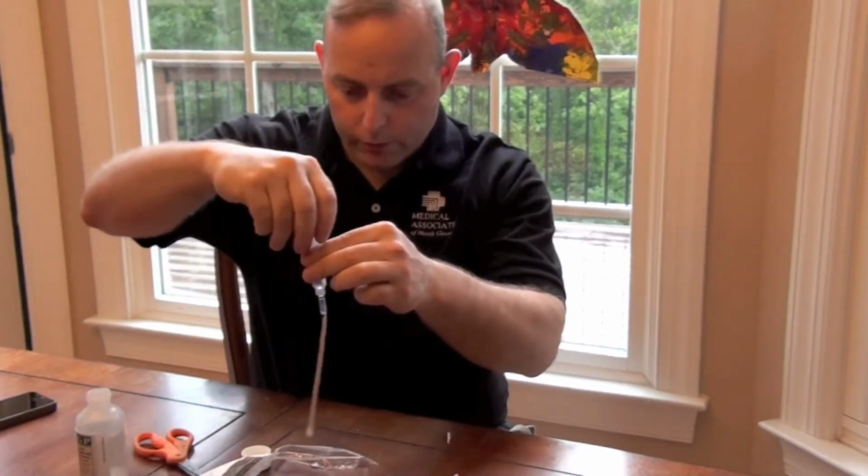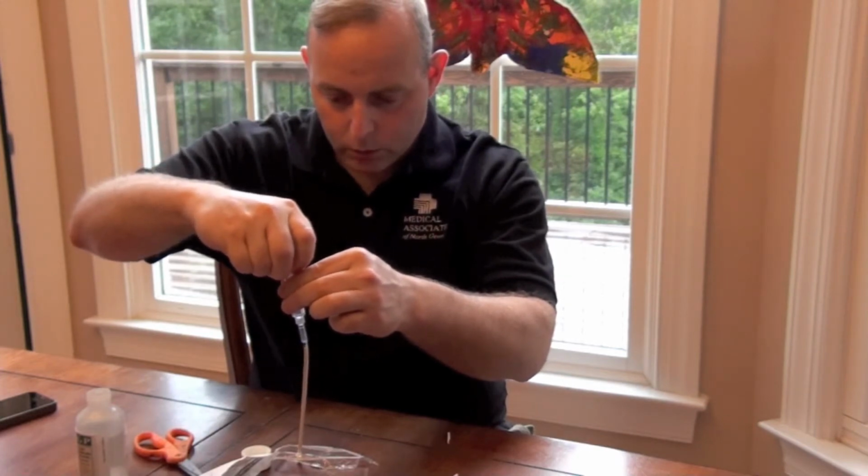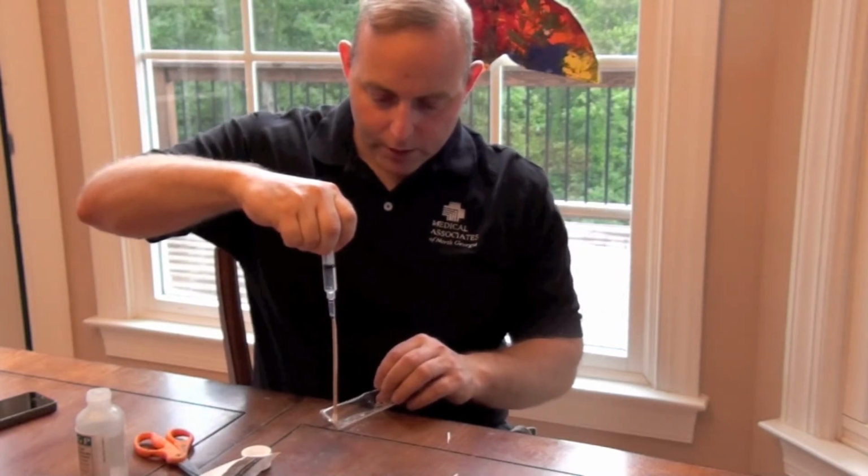And I will hold down. With too much pressure, you can shoot your cotton tip applicator out. Or just like this, you'll see the lidocaine only come out the end.